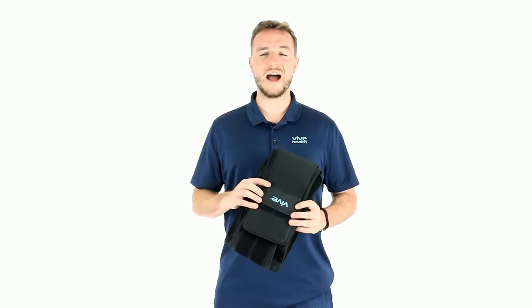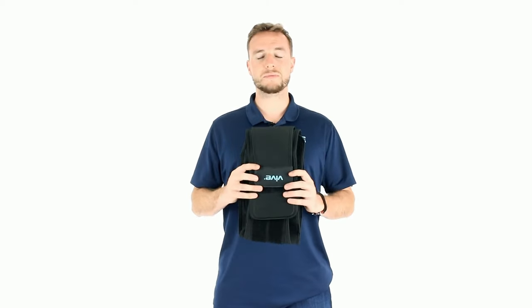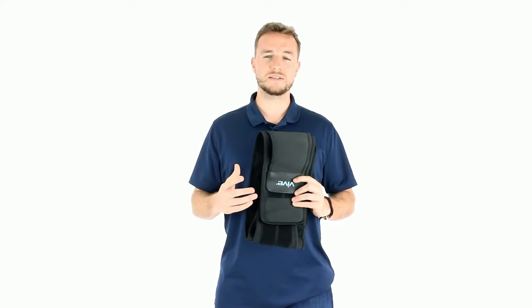Hi, this is Sam with VIVE Health, and today we're going to cover how to put on the VIVE lower back brace. Let's go over the VIVE lower back brace.